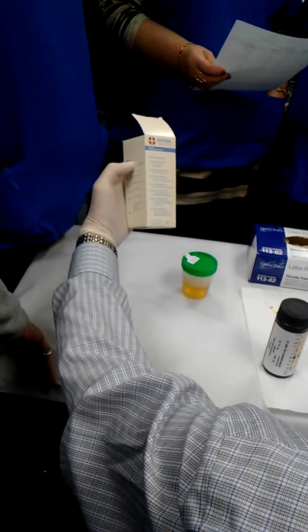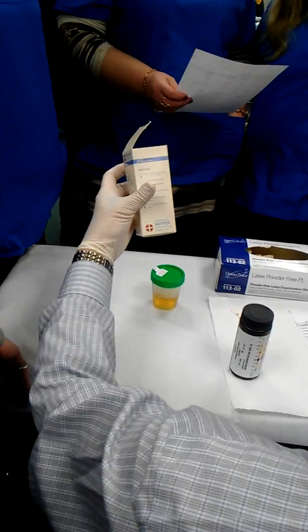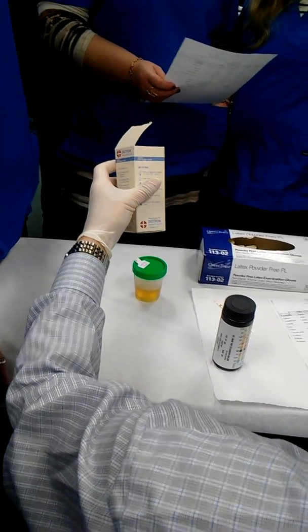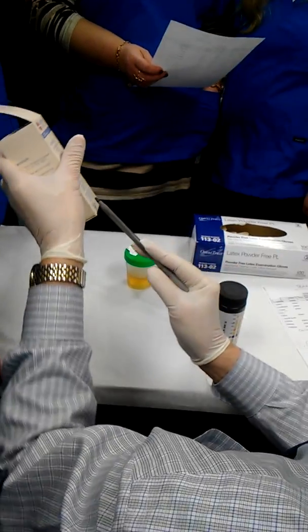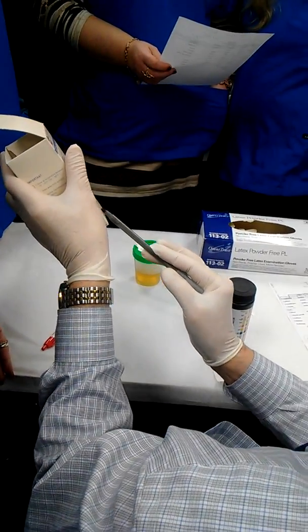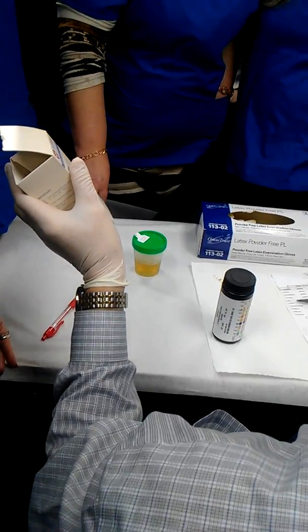And this test, okay, usually they say 10 parameters. You see 10 parameters, right? It's written 10 parameters, 10 things.